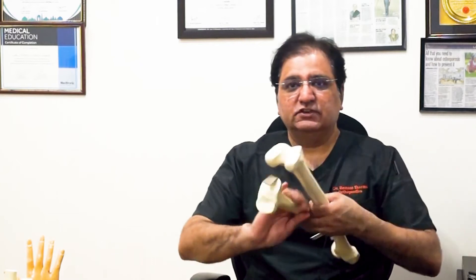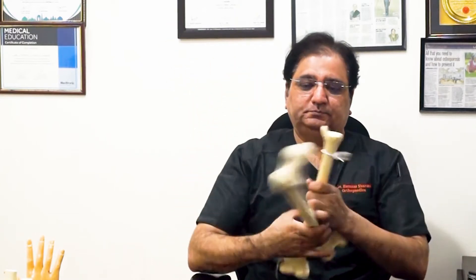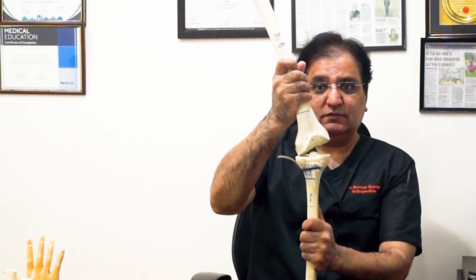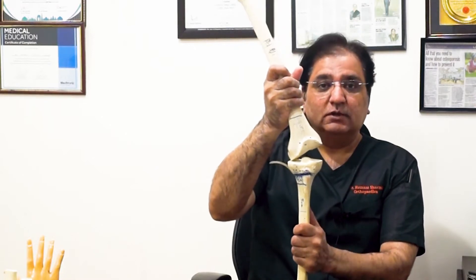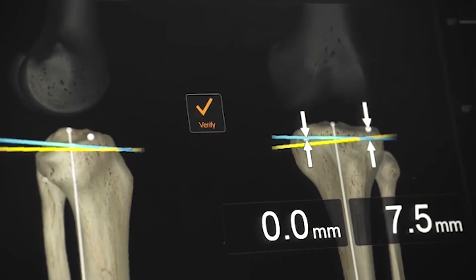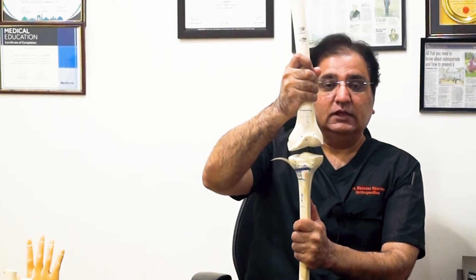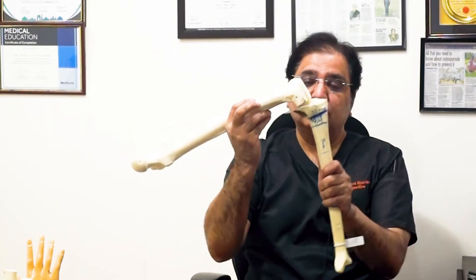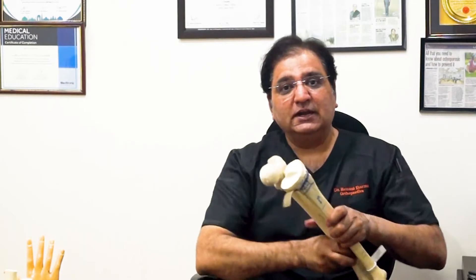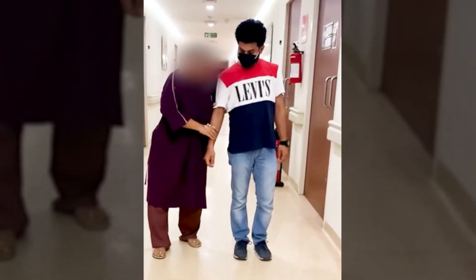The knee replacement done this way improves accuracy. The computer tells us what the problem is before surgery — for example, if the knee is deformed by 16 degrees, it tells us how much to cut, from where to cut, and where to release in order to make it an absolute zero degrees. It also tells us how much bending exists before the surgery, how much bending is achieved after surgery, whether the knee is stable, and what size of implant should be used in order to avoid mistakes.